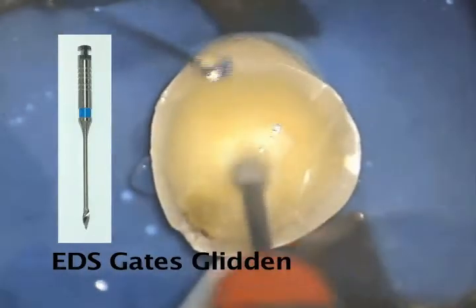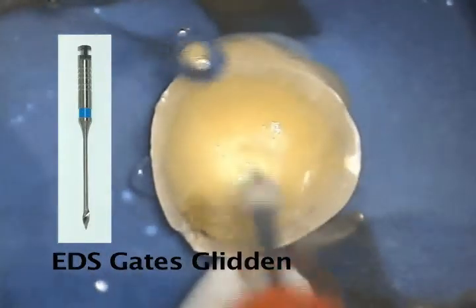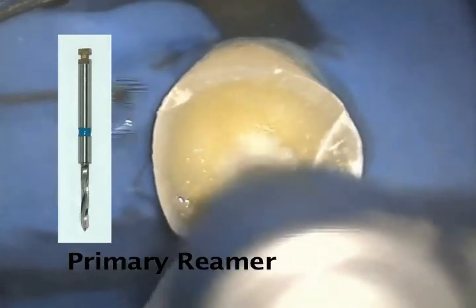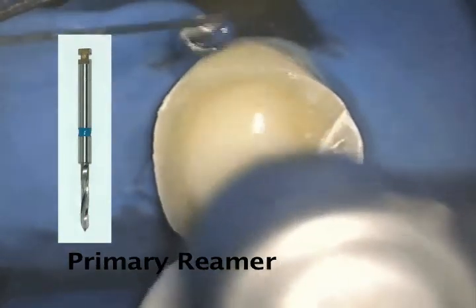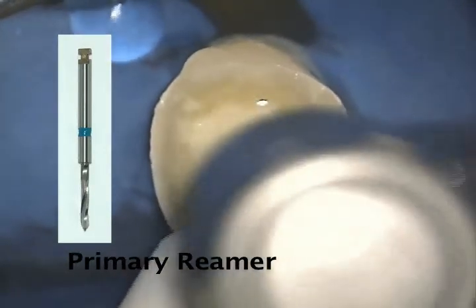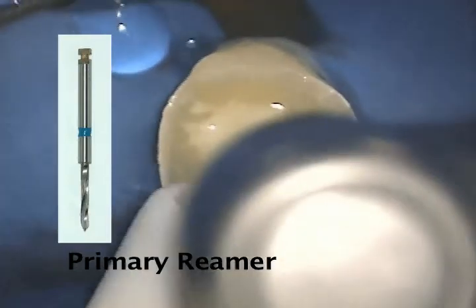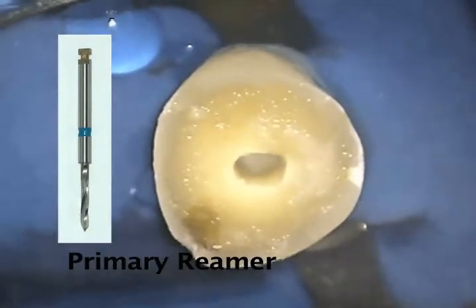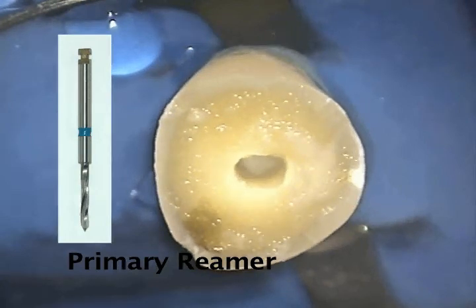Always cut wet with any EDS drill or reamer. The primary reamer for the blue number two fiber post is used until the shoulder contacts the coronal dentin and cannot go any deeper. Try to limit the number of entries into the canal to one or two, since the post depends on a precision fit and we do not want to widen the canal unnecessarily.